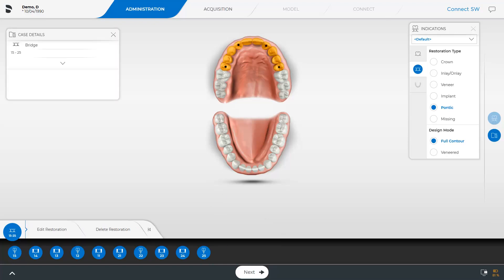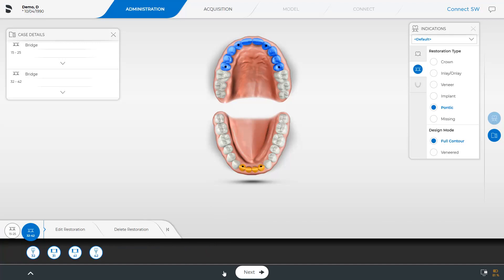We skip the lower jaw workflow, and you will next see the final case details before we move to the next phase. For the upper jaw, an Atlantis superstructure on four implants is planned. For the lower jaw, on two implants. By tapping Next, we get to the acquisition phase.